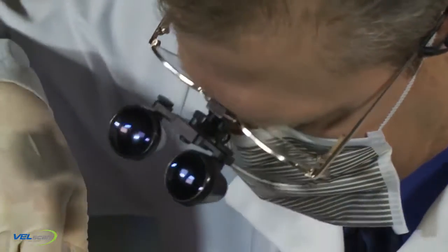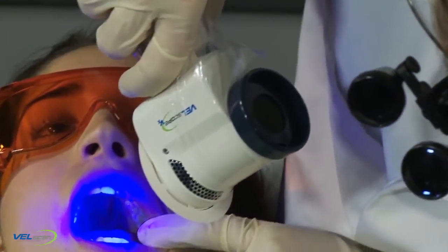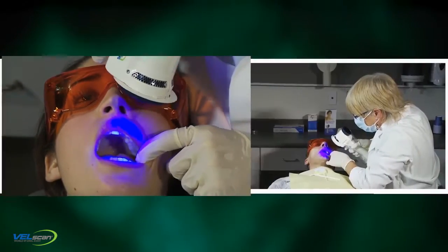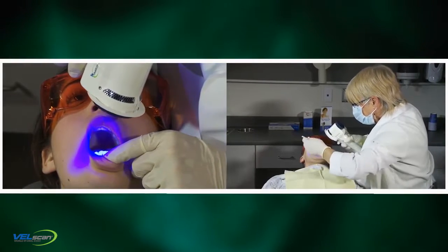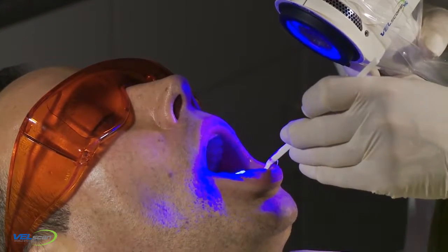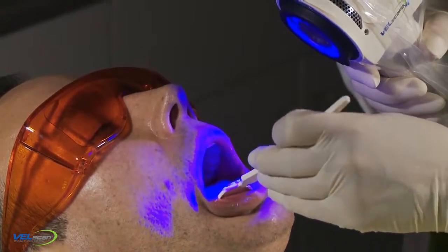The role of the general dentist is to detect tissue variations, abnormalities, and frank pathology, and to establish the best diagnosis possible within the diagnostic processes they are using. The role of the RDH is to assist the dentist in that process by detecting suspicious tissue changes. The dentist-hygienist team can then decide next steps.